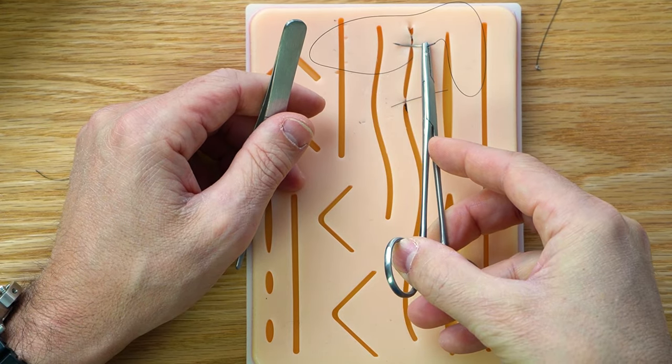So I do that, and again, this is for demonstration because this rubber is not quite like skin, but pretty close. And so I just come back the entire length of the incision, and then all of that gets tangled up, and I will just pull it out there, and then I might even go out the other side, all the way out back there, pull it a little tight, and then cut it off right there. And then I'll just go bing, and it'll dive back underneath the skin, and then you're all done. All right, you guys, so that is a subcuticular suture or stitch.